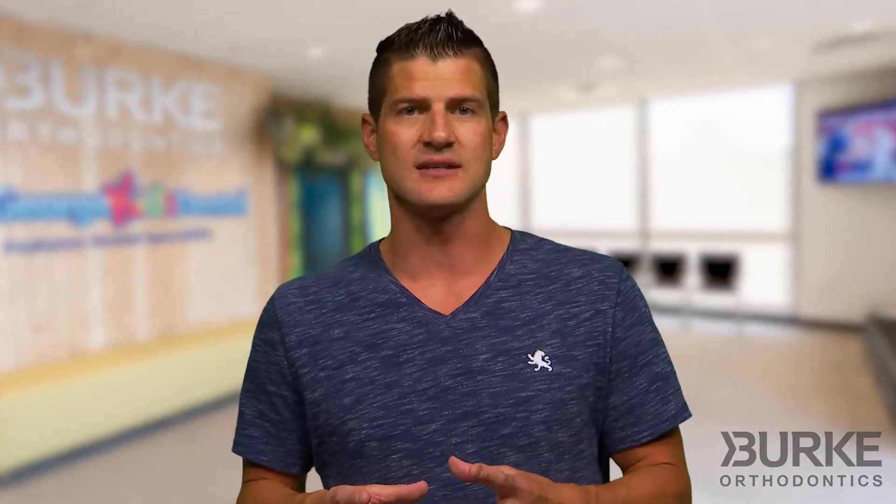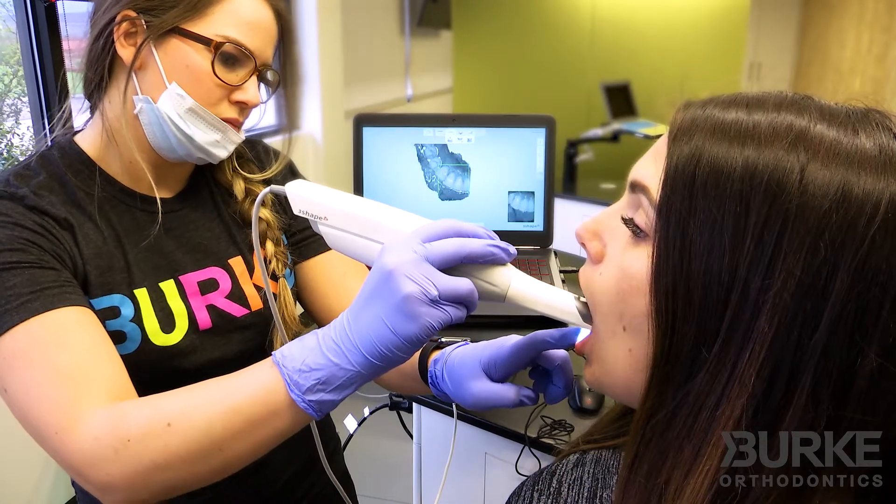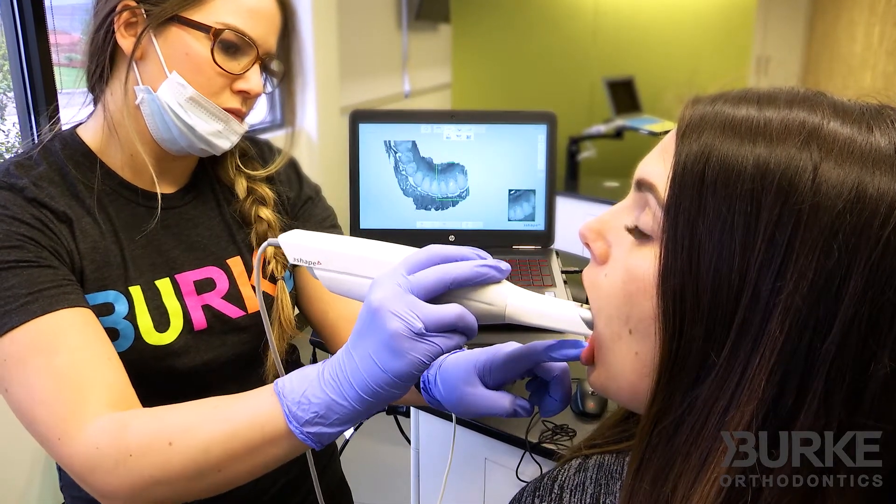One of the coolest and newest advances in the orthodontic profession is that we are now able to take a digital scan of your teeth using an intraoral digital scanner. The scan is done in our office and our staff is trained to finish a scan start to finish in under 10 minutes.